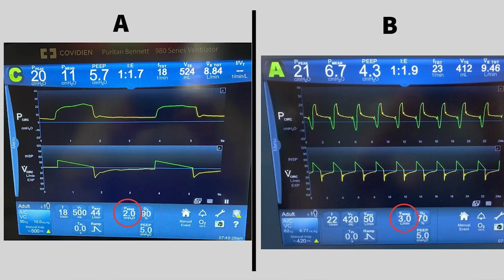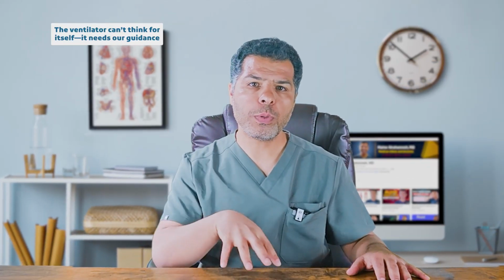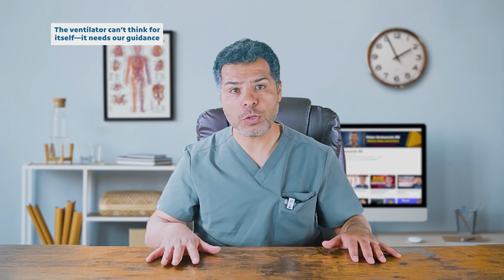On picture B, the V sense word represents the flow trigger set at 3 liter per minute. This means the patient must draw in at least 3 liter per minute, approximately 50 ml per second, for the ventilator to deliver a breath. Now, whether using a flow trigger or pressure trigger makes no clinical difference. Neither offers a clear advantage over the other.